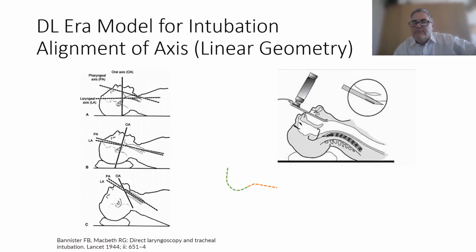So Greenland's model explains direct laryngoscopy by flattening of curves. The direct laryngoscope flattens the primary curve, and then lifts the jaw and tongue to flatten the secondary curve, creating a straight line to intubate with. That explains direct laryngoscopy just fine.